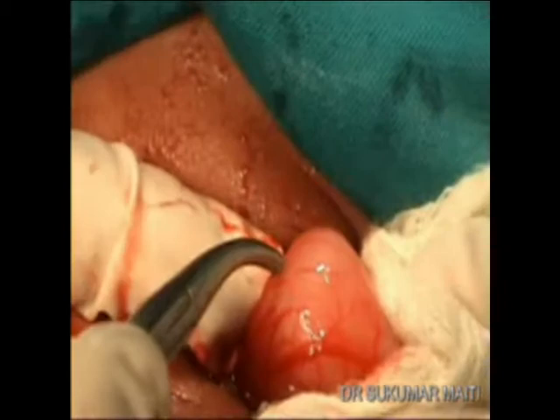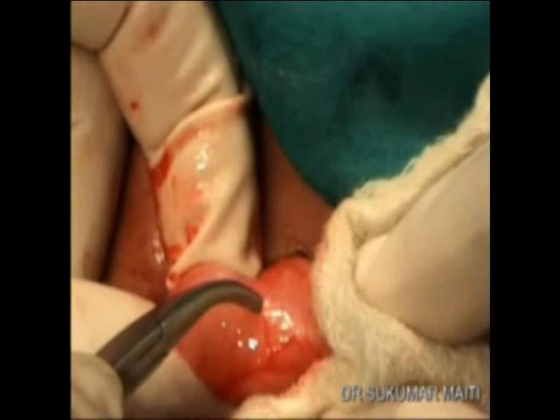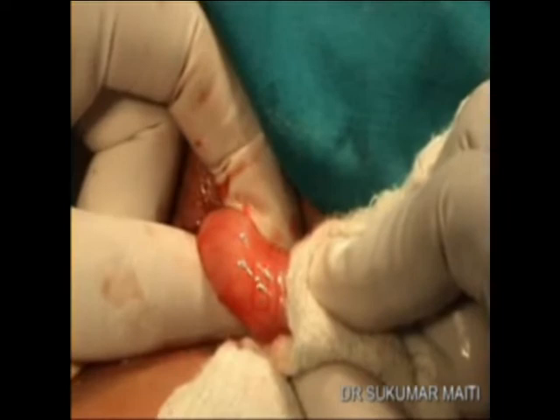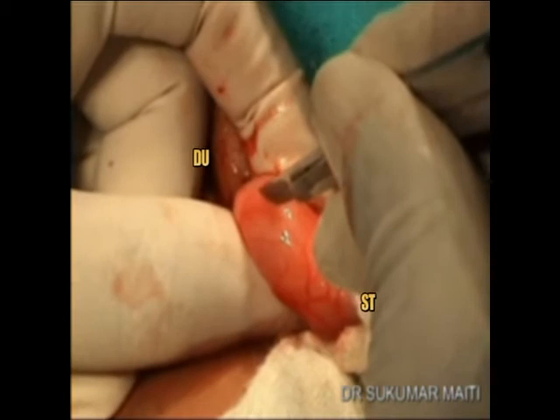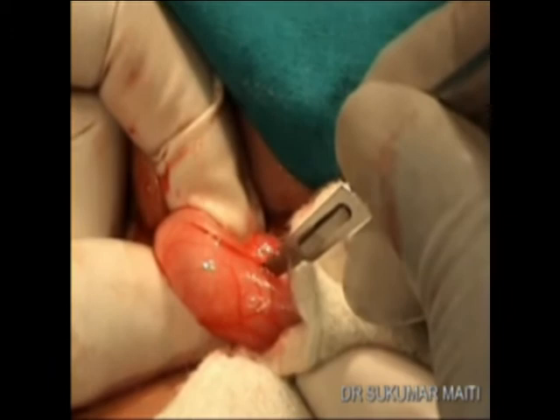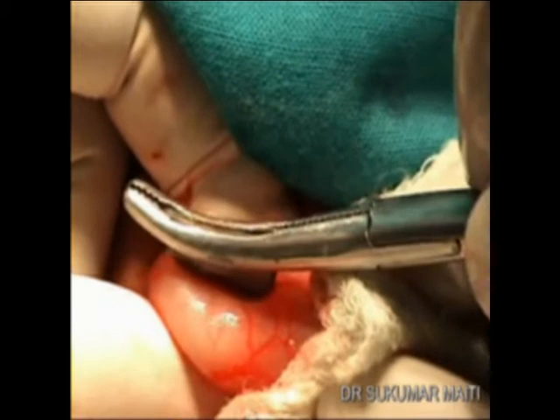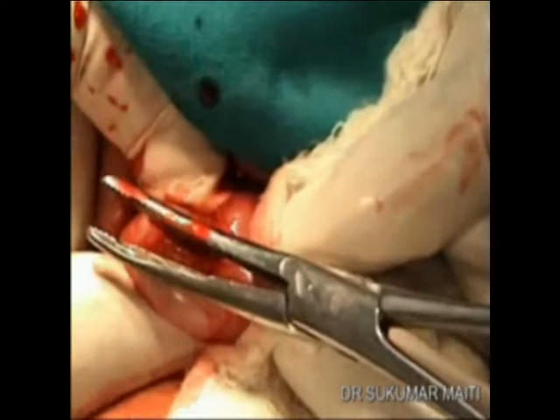After the tumor is delivered through the incision, the gastroduodenal junction is identified by the prepyloric vein and a white line. The tumor olive is grasped securely with the left thumb and index finger. A superficial incision is made through the relatively less vascular area from the duodenum towards the stomach side. The closed blades of the instrument are thrust into the tumor against the counter pressure made by the left hand. The blades are then opened to complete the separation of the muscles.